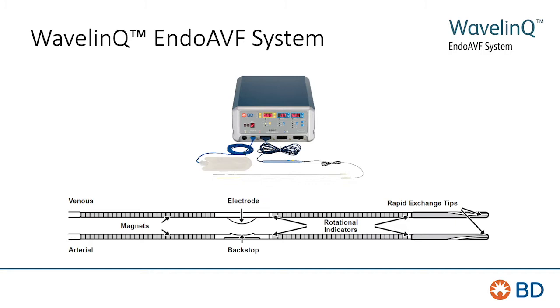How is there not some giant pseudoaneurysm? There really is no magic to this. You're burning a hole and the blood is following the path of least resistance, since the WavelinQ device is using RF energy to cut from the venous side to the arterial side to create an endovascular AV fistula.